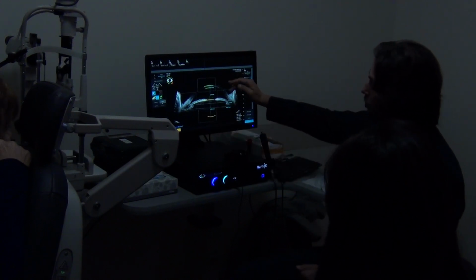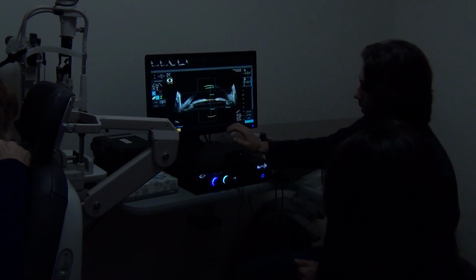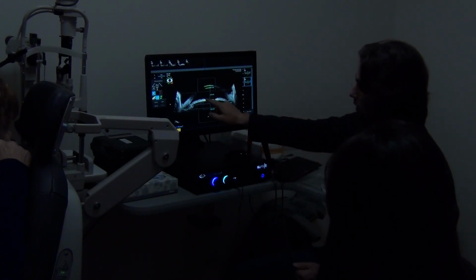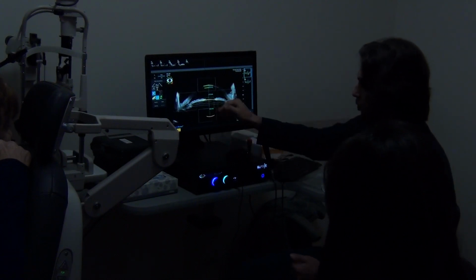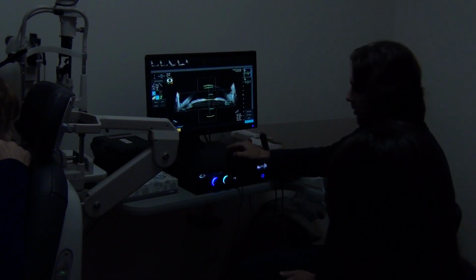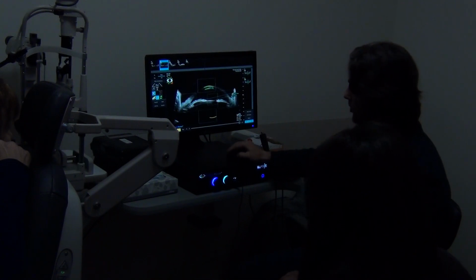So always watch for cornea, front and back of the lens. All three of them have to be on the screen. Then you are looking at the largest area of the pupil. That's the diameter of the pupil, so that means you are in the center. And that's it. So let's look at this image. We're going to click play. So we did it the second time, right?